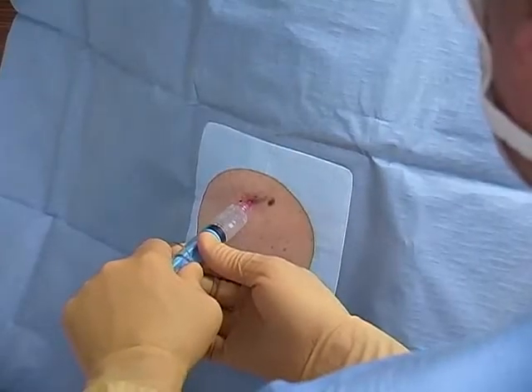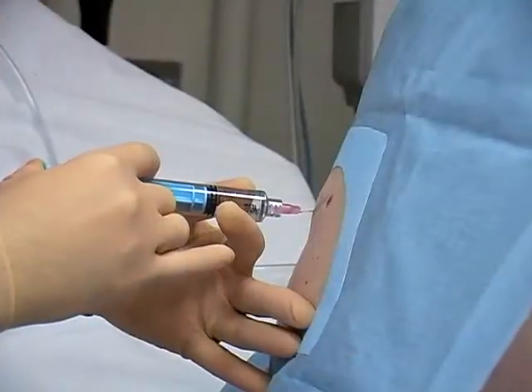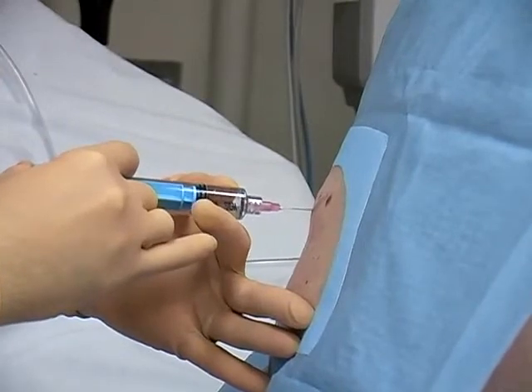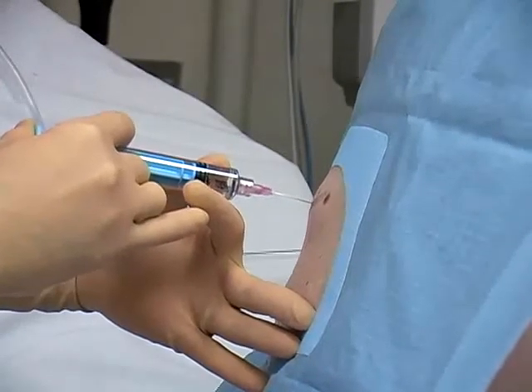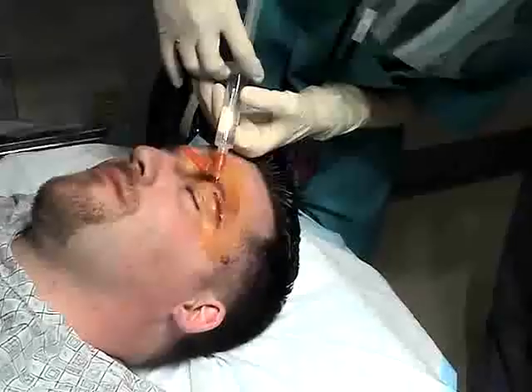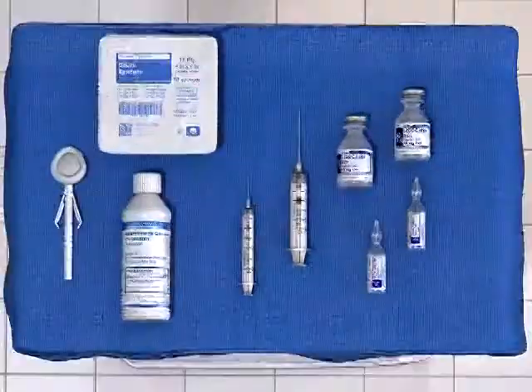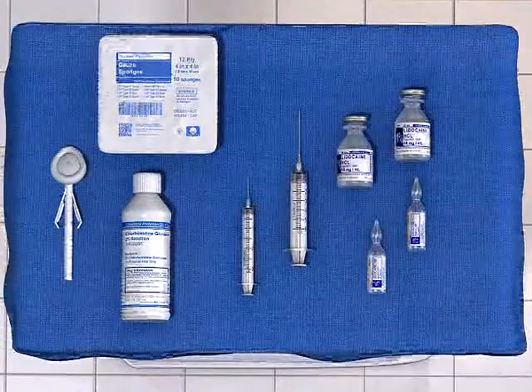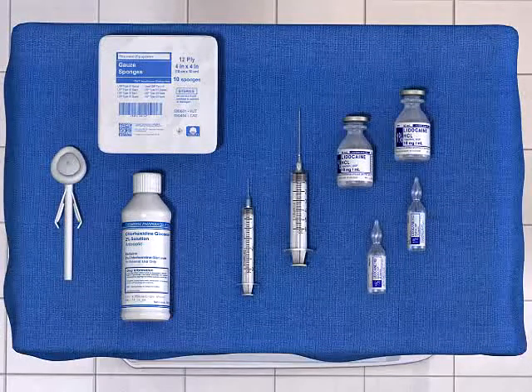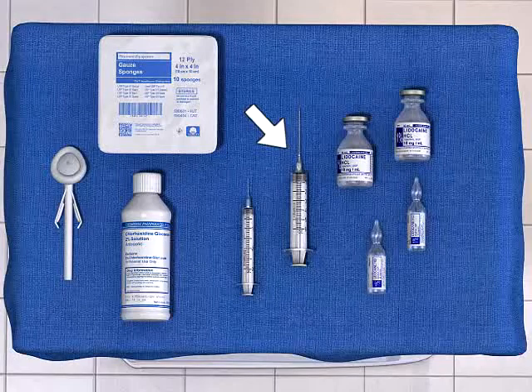Local anesthesia is utilized in a wide variety of medical procedures to achieve local, short-term analgesia with minimal risk for side effects or complications. Examples of indications include arthrocentesis, laceration repair, and thoracentesis. Only a few pieces of basic equipment are required for the administration of local anesthesia. These include a skin cleansing agent such as chlorhexidine, a small syringe, and 1 or 2 bevel-tipped needles.